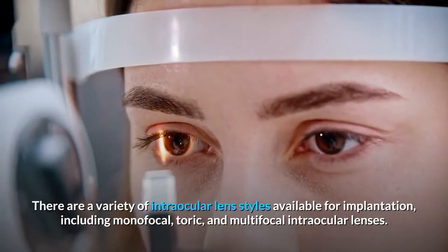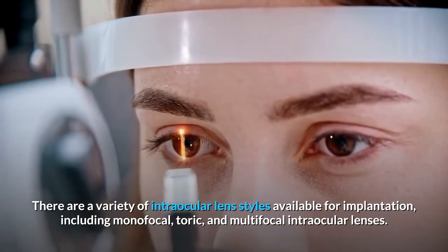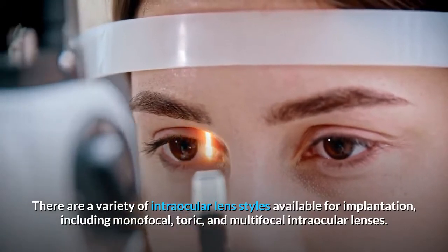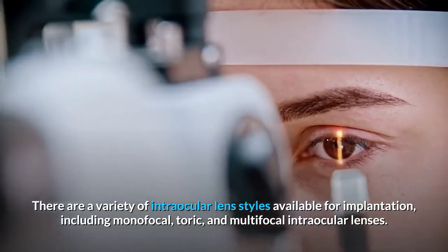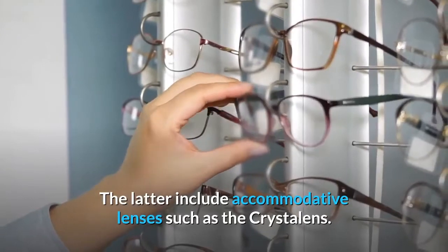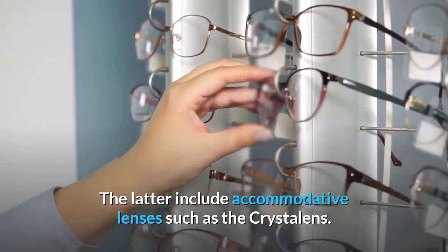There are a variety of intraocular lens styles available for implantation, including monofocal, toric, and multifocal intraocular lenses. The latter include accommodative lenses such as the crystal lens.